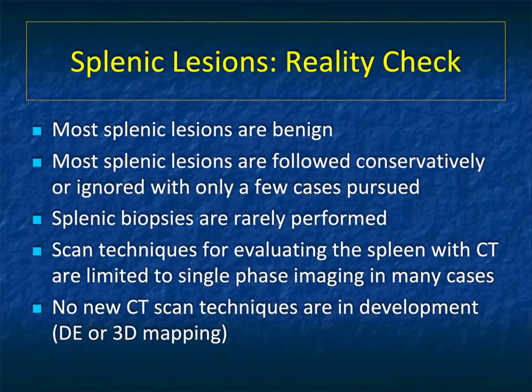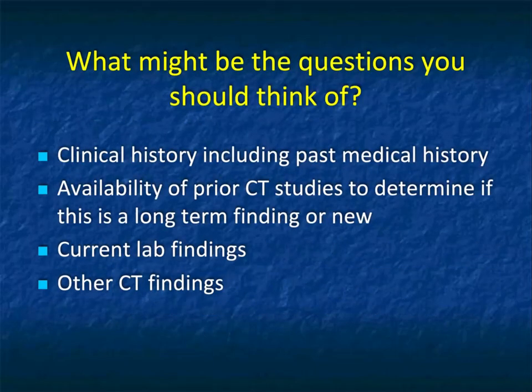You can have single or dual phase. Most of the time you have single phase imaging. And there really are no good contrast agents for the spleen or no really dynamite splenic imaging techniques beyond dual phase imaging and perhaps doing 3D mapping.